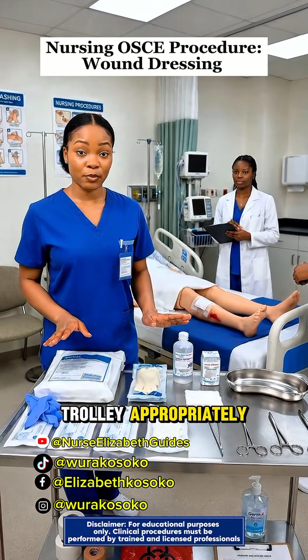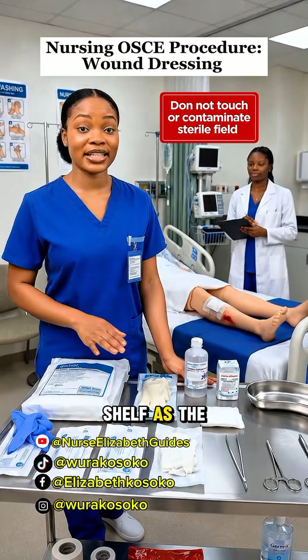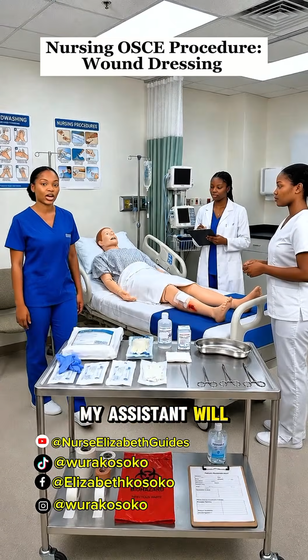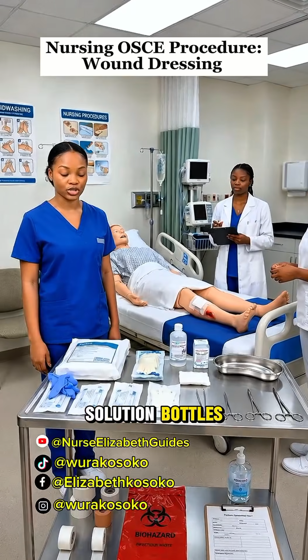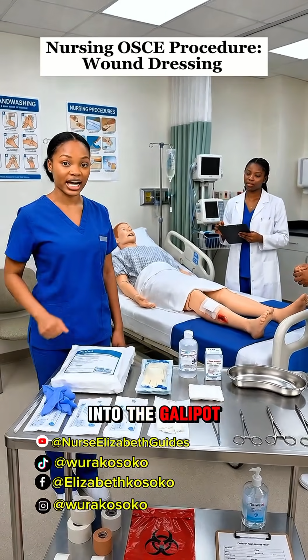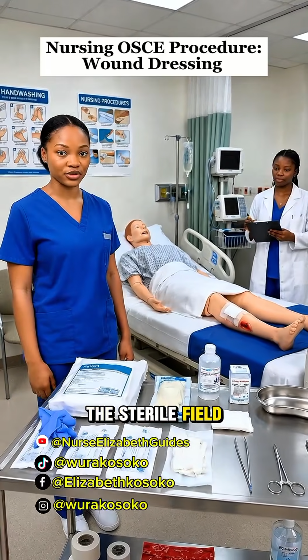I arrange the trolley appropriately, maintaining the upper shelf as the sterile field and the lower shelf as the clean area. My assistant will handle items from the clean area, such as opening solution bottles, pouring prescribed solution into the gallipot, and passing required supplies without contaminating the sterile field.